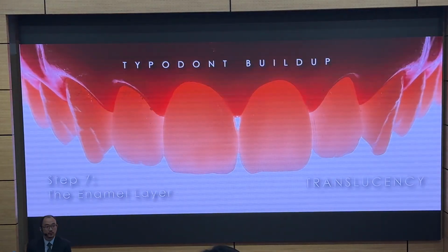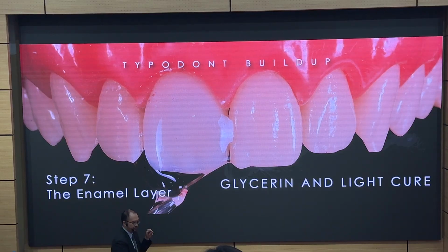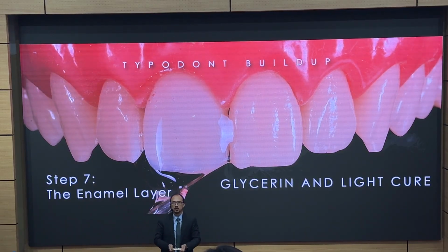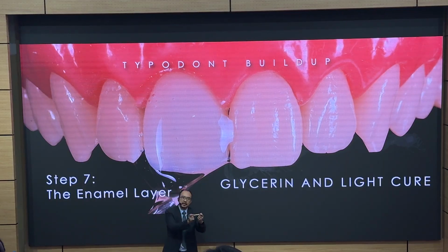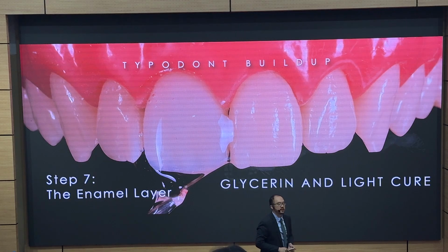And that's how it looks so far. Now, I want to spend a little bit of time to talk about glycerin. How many of you have heard of something called the oxygen inhibition layer? Some of you have heard of it, some not. Now, what does it mean?